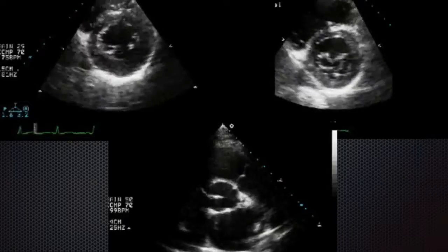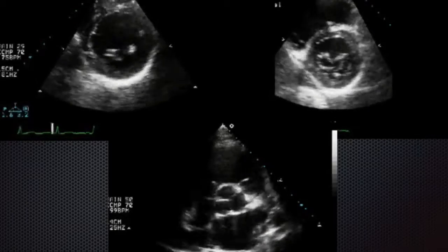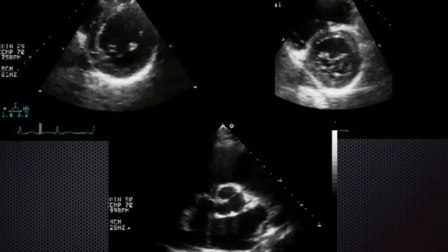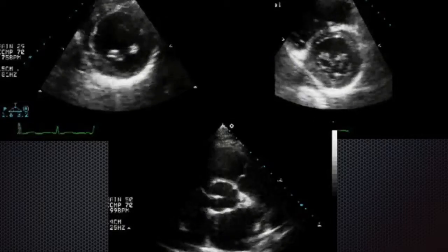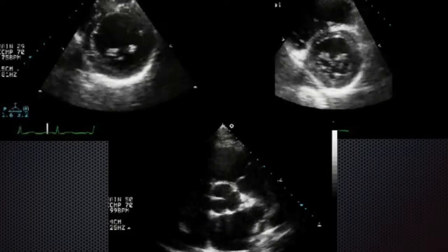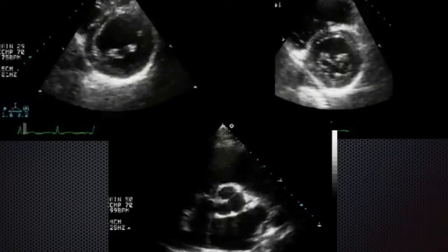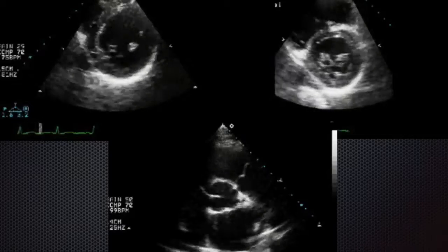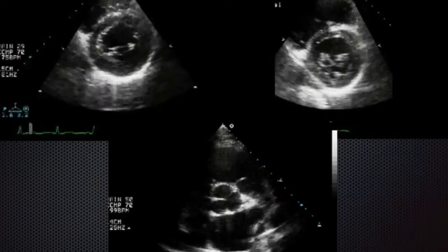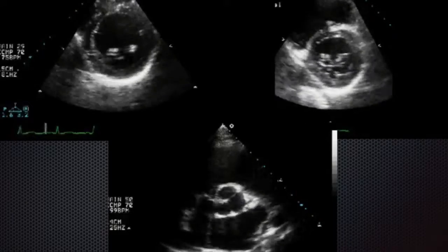Another good thing to do is imagine sticking your thumb in the middle of the dancing left ventricle donut. All the walls should come towards it, and that reflects a radial contraction. The radial contraction inwards should reduce the internal diameter of the left ventricle by about a third during contraction. That's called fractional shortening.